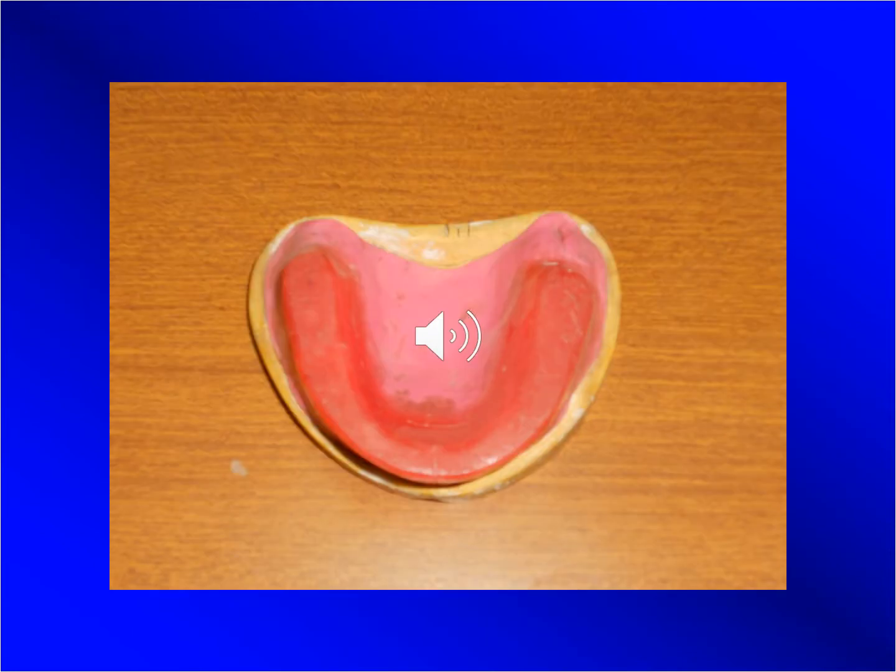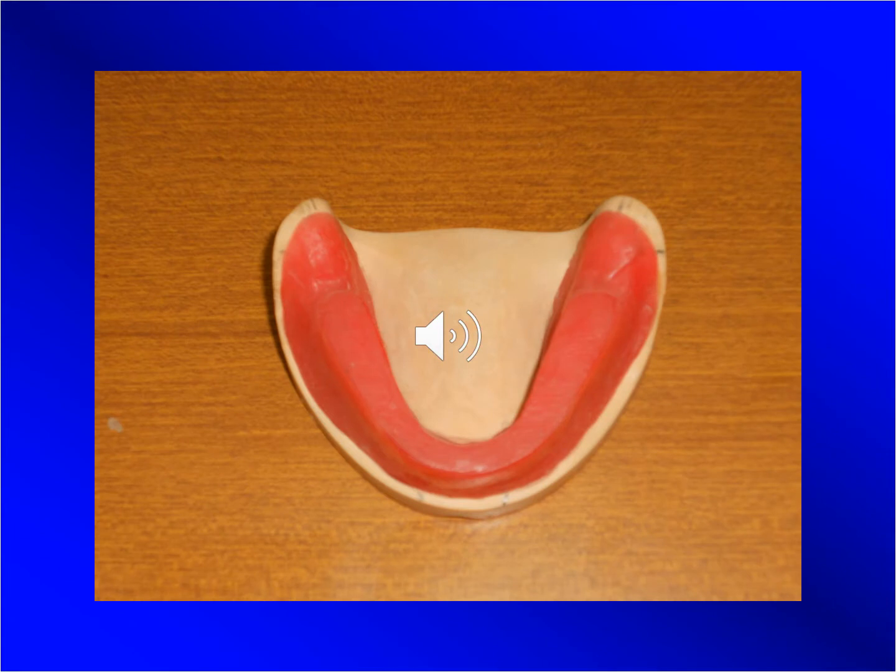Then on these master models, bite blocks are going to be constructed for both the upper and the lower arches. These bite blocks are going to be adjusted, of course, inside the patient's mouth to give the most ideal arch form that will follow the neutral zone concept, to locate the occlusal planes of the upper and the lower most appropriately, and to record the vertical dimension of occlusion according to which the teeth are going to be set and the dentures constructed, and also finally to have the maxillomandibular relation at that vertical dimension of occlusion recorded using these two bite blocks.